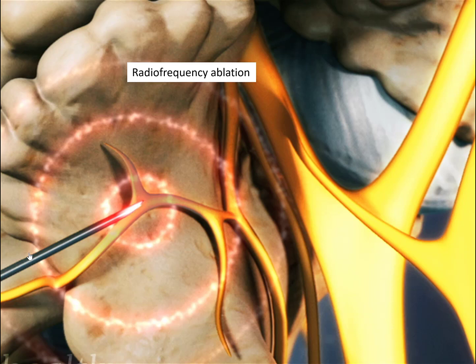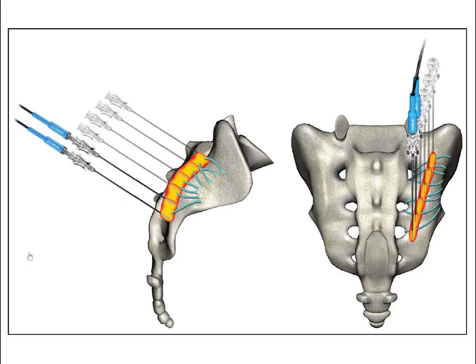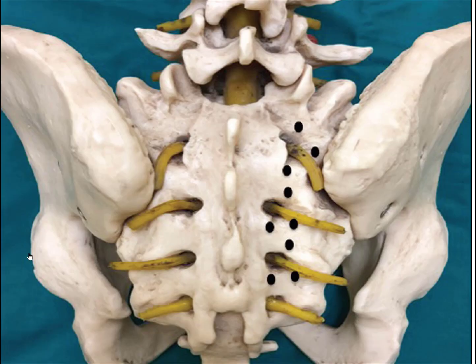So other treatment options are radiofrequency ablation, to denervate basically the SI joint in some way, which comes from the sacral foramina, and there's a whole art, or science, I don't know, of where to put the needles exactly. And there are many articles for this. And interestingly, for this model, they did an SI joint fusion. See where the screws are on the right?